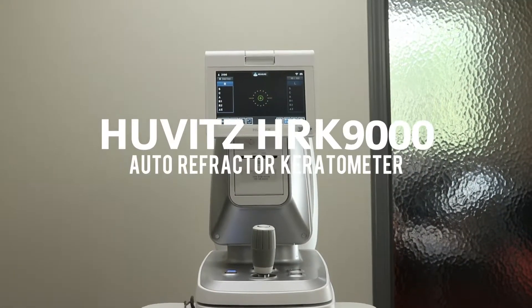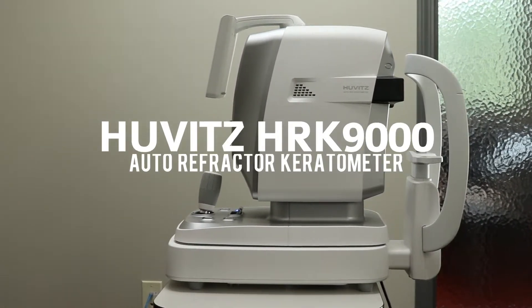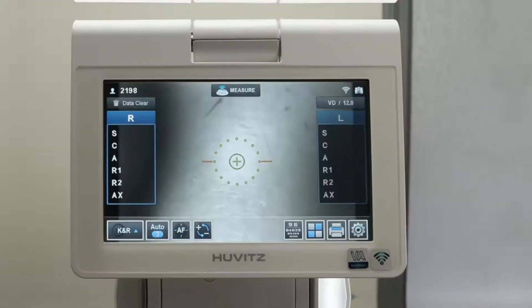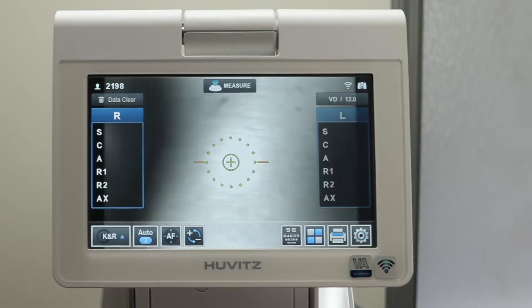The Huvitz HRK-9000 autorefractor keratometer with a three-year warranty from Norwood Device and Diagnostics. The HRK-9000 is a feature-rich autorefractor with a user-friendly interface.